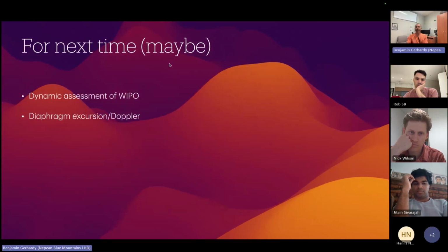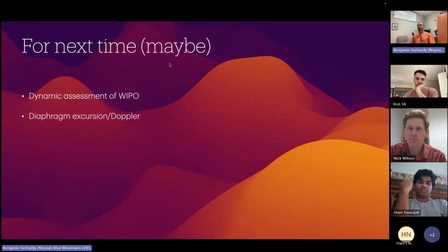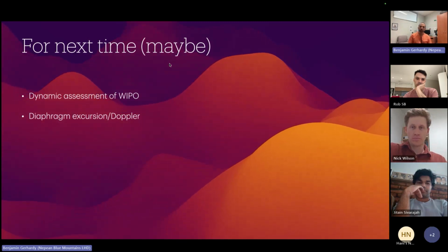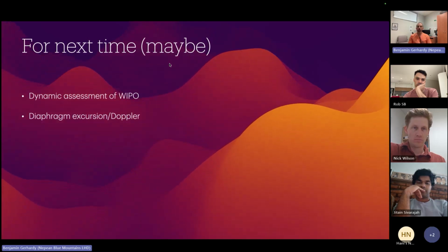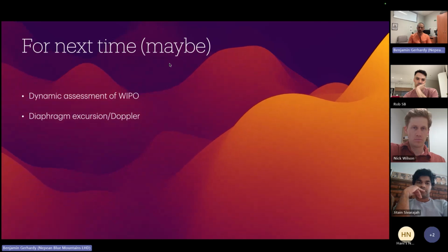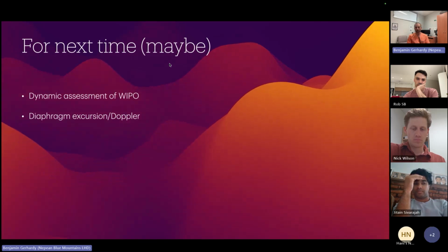And that's where I was going to stop. So things I didn't cover, and the things that can be thought about in terms of lung or chest ultrasound, is dynamic assessment of weaning-induced pulmonary edema. For anyone that's doing the EDEC program, or has seen any of the EDEC lectures of the European Diploma of Echo, they have some resources and a lot of discussion around that. Looking at someone's left atrial pressure, and then as you extubate them, seeing what their B lines are like and engaging that.